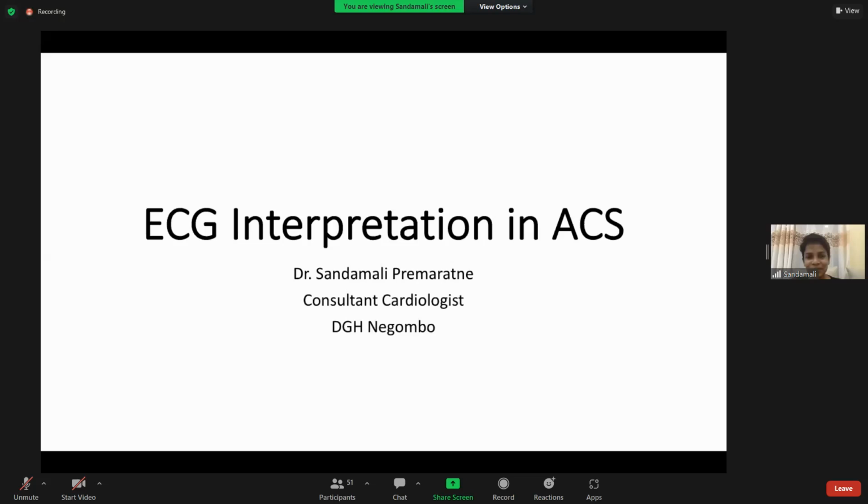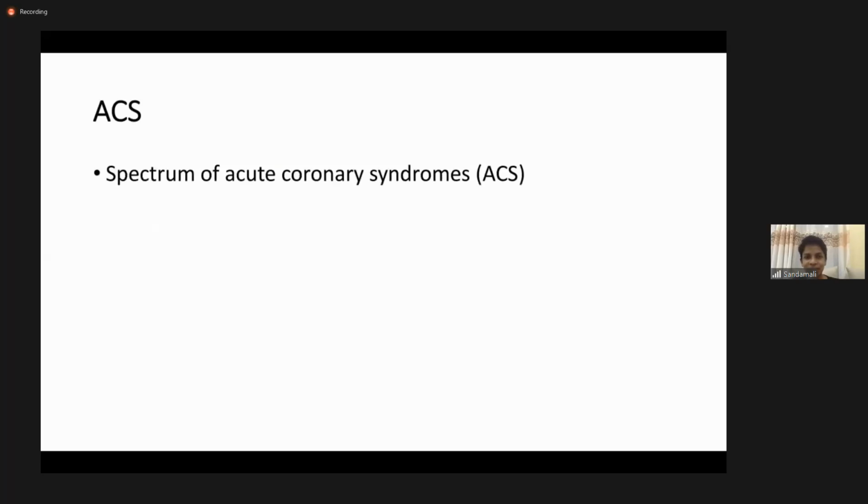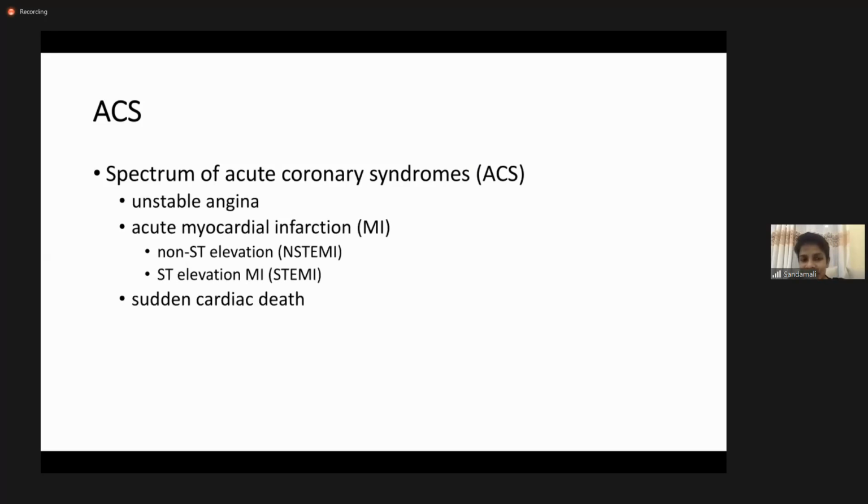I'm going to do this talk on ECG interpretation in acute coronary syndrome. First of all, you all know from last week's lecture that acute coronary syndrome includes a spectrum of conditions, including unstable angina and acute myocardial infarction, of course, even sudden cardiac death. Acute myocardial infarction can present as either ST elevation myocardial infarction or non-ST elevation myocardial infarction.